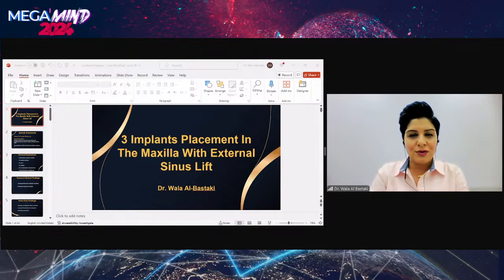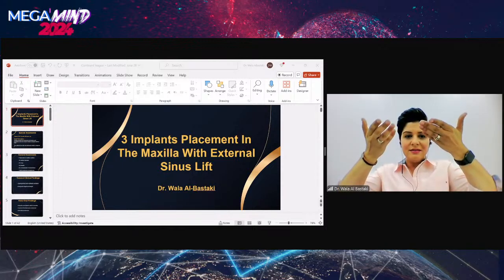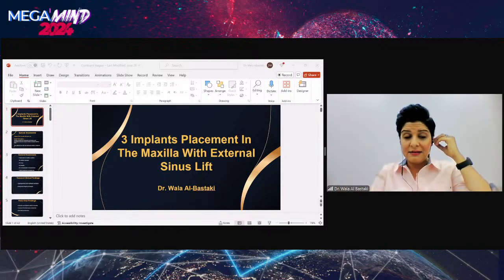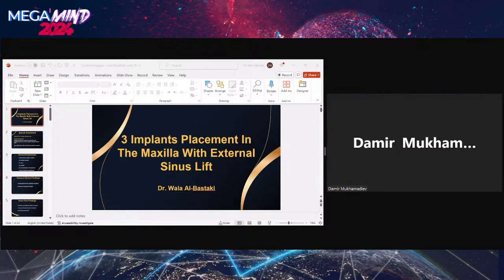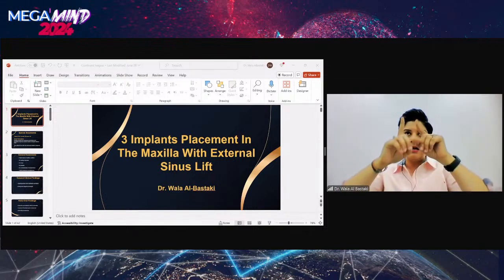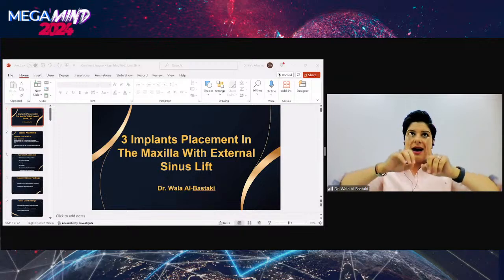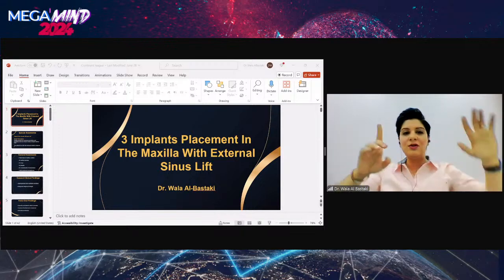It was just to support the implants and cover them. But what's the reason for so much material above the implant? Because the membrane was elevated, so I wanted to fill this area. Okay. Yes, the Schneiderian membrane was up. The implants were seen outside the bone apically and outside the ridge, and then I wanted to cover them.